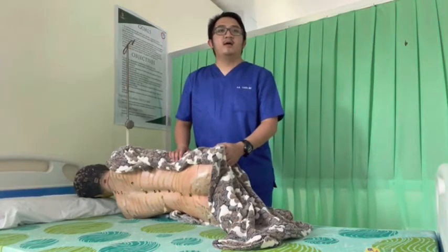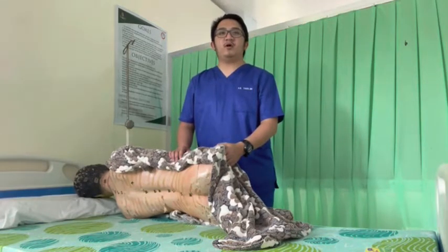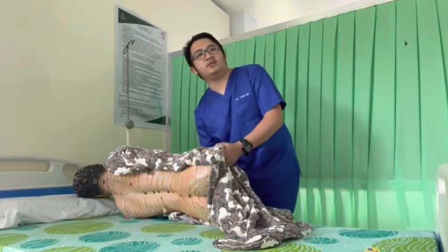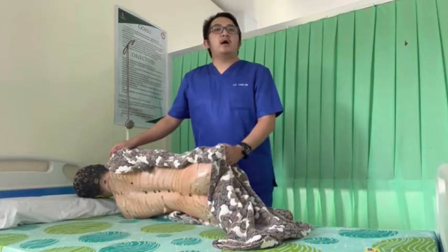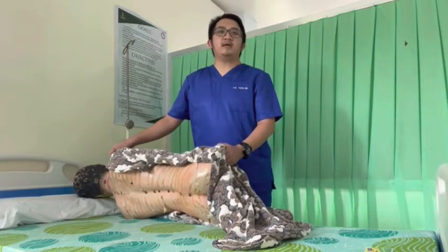Next, the nurse assists the patient to maintain the position, to prevent trauma to the spinal cord area. The patient is encouraged to relax and is instructed to breathe normally, as holding the breath may interfere with the pressure reading. The nurse describes the procedure step by step to the patient as it proceeds to alleviate anxiety.